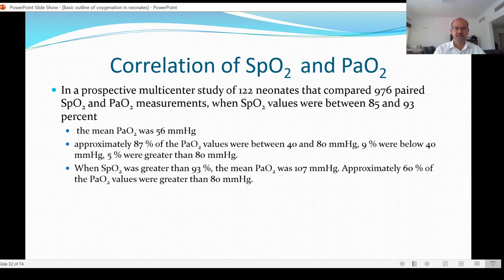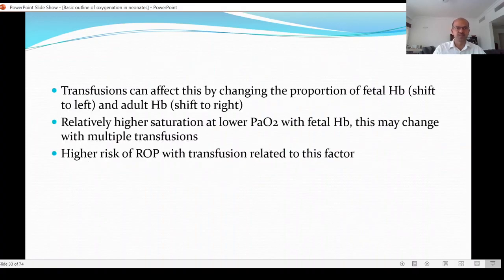So it's very important that we monitor and titrate according to the needs. And when you say a target range of 90 to 95, you will have briefly hitting 95, but as long as it's in that range, it should be reasonably okay. And as I said earlier, the PaO2 will not go excessively high if FiO2 is not too high.